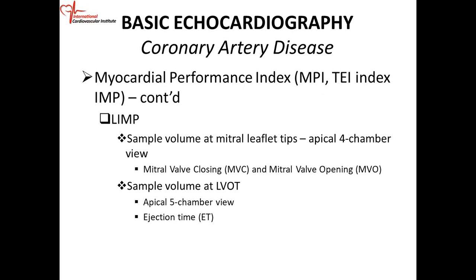So when we're doing LIMP, you put your sample volume at the mitral leaflets, apical four-chamber view, and you put your cursor sample volume at the mitral valve leaflets, and the definition for LIMP is mitral valve closure to mitral valve opening minus ejection time divided by ejection time. So essentially the same definition that you use on the right side. Okay, so LIMP. Okay, it's done.